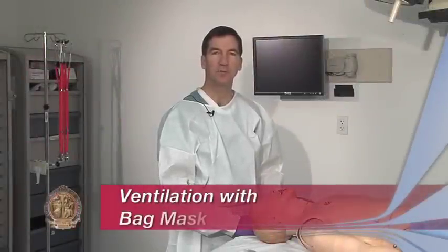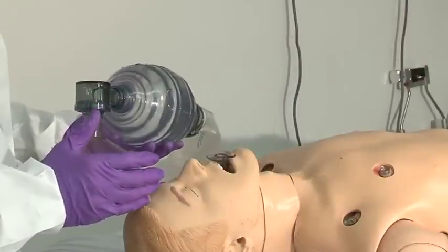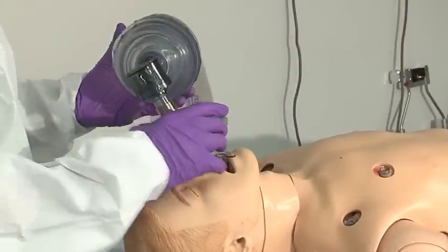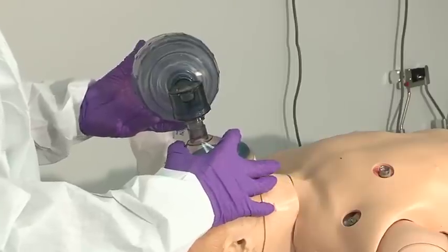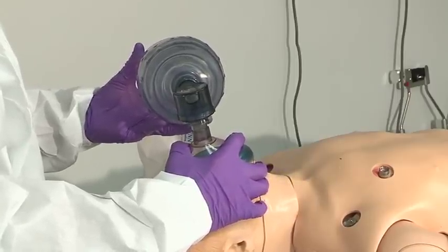Providing oxygen for the trauma patient is a critical concern. One of the easiest ways to do that in the resuscitation area is with the bag mask device. In this patient, I've already placed an oral pharyngeal airway. I make sure that my mask is fixed comfortably over the mouth and nose, and then I get a good seal by grasping the mask and securing it by holding on to the mandible.